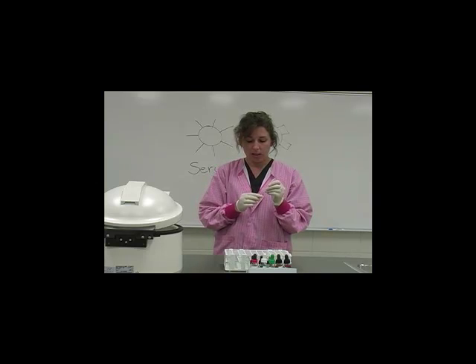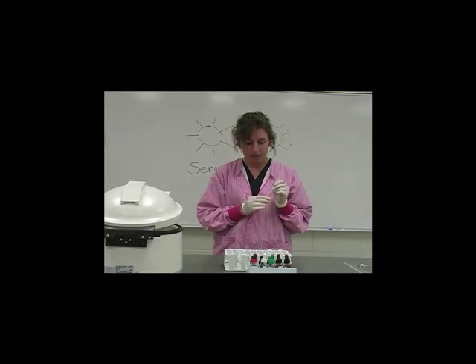So the first thing that we're going to do is we've got our test tubes laid out here, and I'm going to add a drop of the blood cells into each tube, and we're going to find out what the blood type actually is.